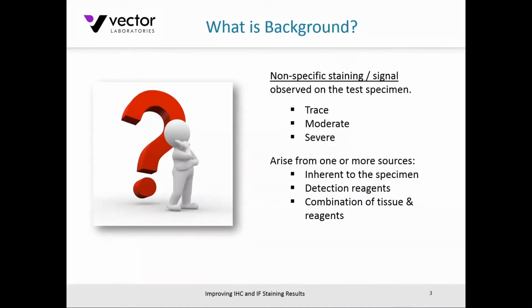All right, so let's dive into it right now. What is it I'm referring to when I talk about background? Here is a little bit of a definition: non-specific staining or signal observed on the test specimen. I am using the phrases background and non-specific staining interchangeably. But really what I'm getting at is unwanted staining on your test specimen. It might be observed as a trace or weak staining, maybe an overall toning across the tissue section. That might not be too problematic, particularly if your specific signal is highly expressed and you've got a very good demarcation in the signal to noise ratio.